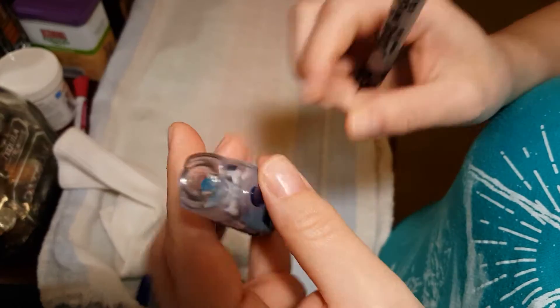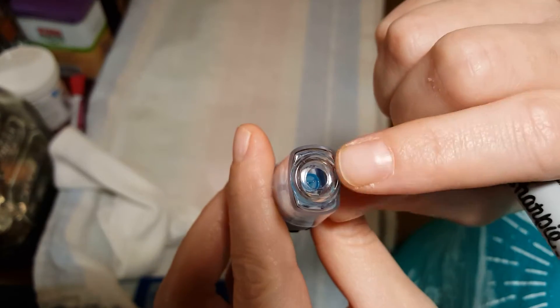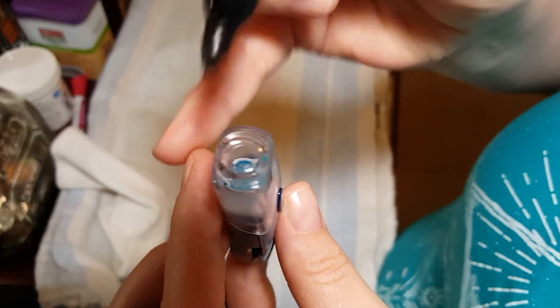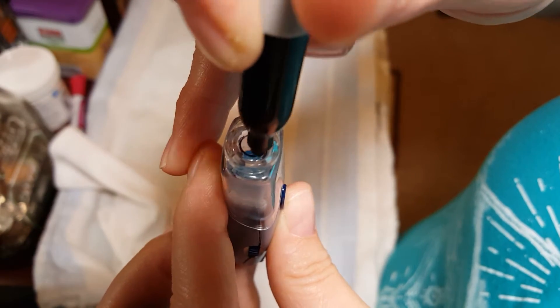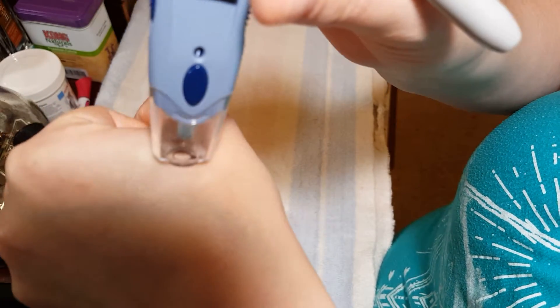One of the things that makes it easier is that the lancet poker — whatever this thing is called — is clear, so whenever you stick it to the cat's ear you can't really see what you're doing or where it's going. So if you just take a black sharpie and rim the line here, then whenever you stick it on the skin you can see a ring, and that helps.